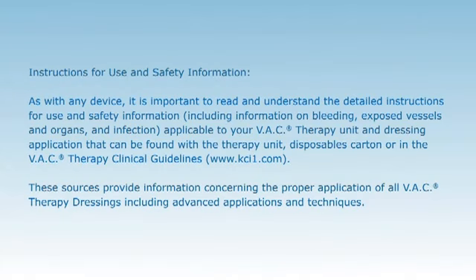Instructions for use and safety information. As with any device, it is important to read and understand the detailed instructions for use and safety information, including information on bleeding, exposed vessels and organs, and infection, applicable to your V.A.C therapy unit and dressing application that can be found with the therapy unit, disposables carton, or in the V.A.C therapy clinical guidelines.